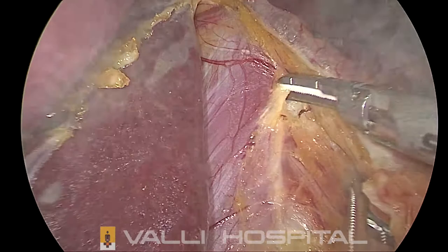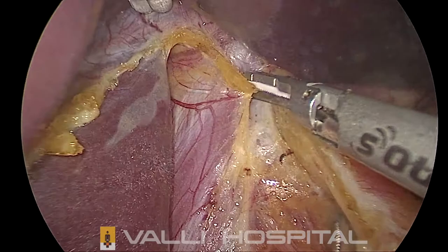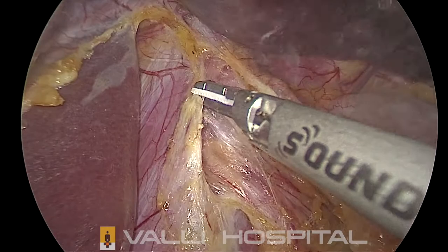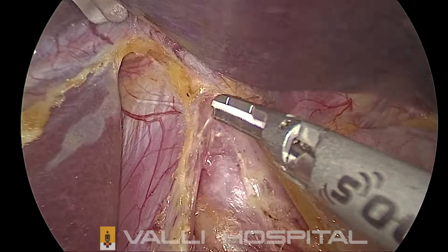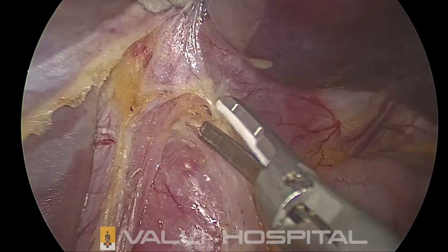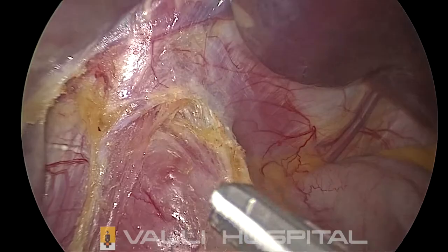Here the technique is, you have to use a blunt dissection and a sharp dissection. First you do the blunt dissection. You see, I am doing now the sharp dissection, then the blunt dissection, then again the sharp dissection. Once the cleavage is seen, then you can start dissecting in between the esophagus and the right crus. Our idea is just to circumferentially dissect the esophagus from right to left. I am now cutting the phrenoesophageal membrane anteriorly.